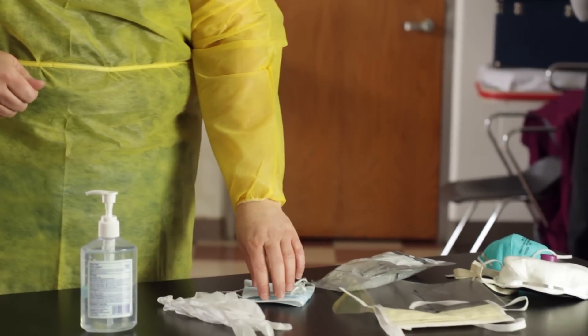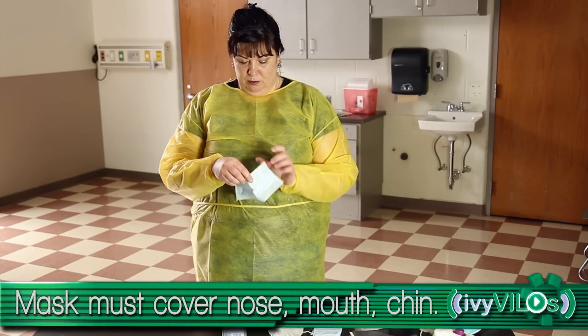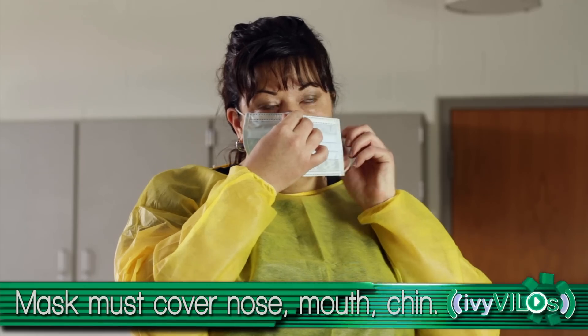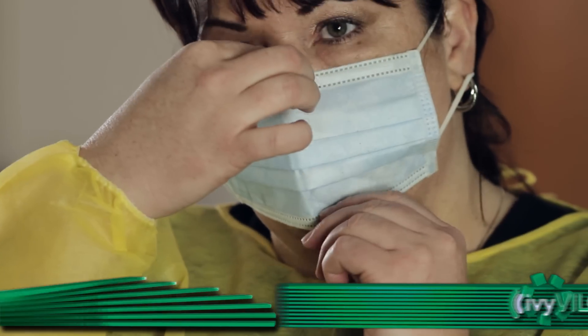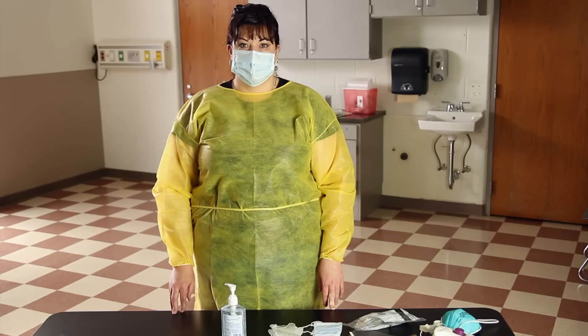If a mask needs to be used, place the ties or elastic bands at the middle of the head and neck or around the ears. The mask should cover your nose, mouth, and chin. Perform a fit check by inhaling and exhaling. When using a respirator, the respirator should collapse and no air should leak out.